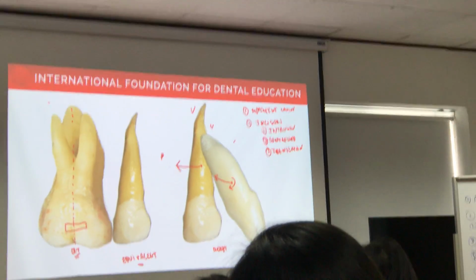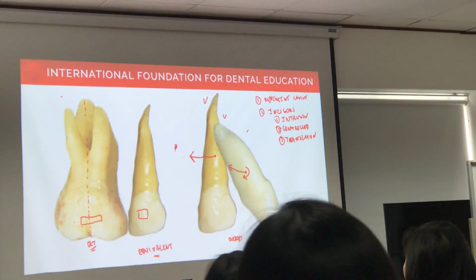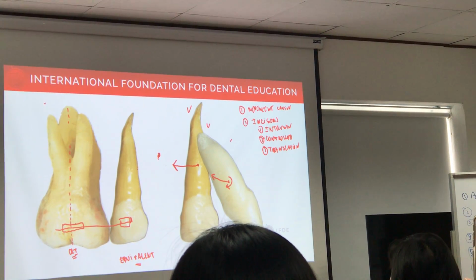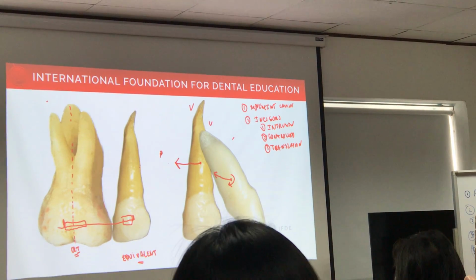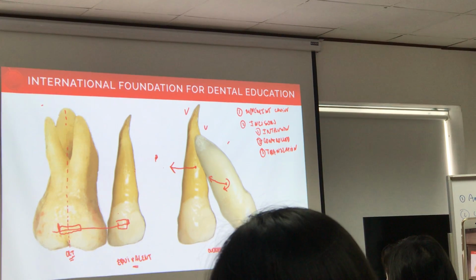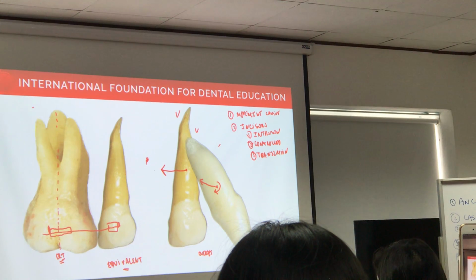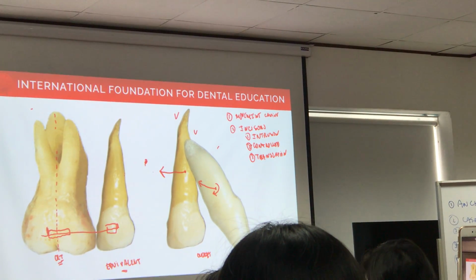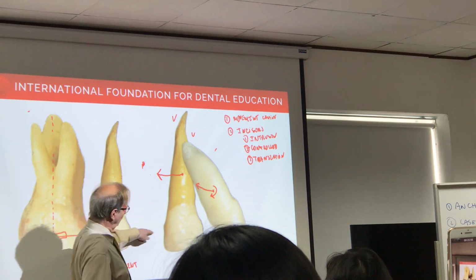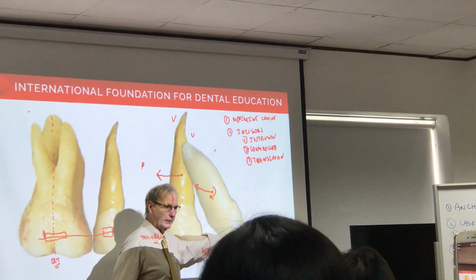Because of this balance of forces, what happens to the posterior group of teeth? And we have this unit. Let's assume we tie in tooth 6. One good point I'm going to make, and I'm not going to draw on this, I'm going to use my fingers. If you use the straight wire system, just for fun, where is the wire going? The wire will go through tooth 3 and then down into the incisors.